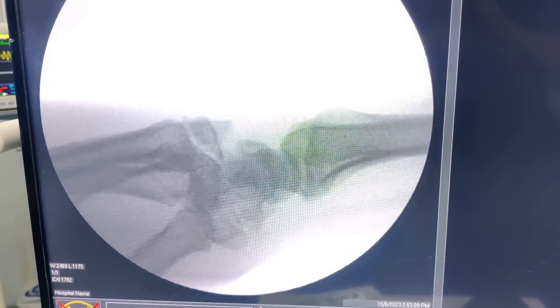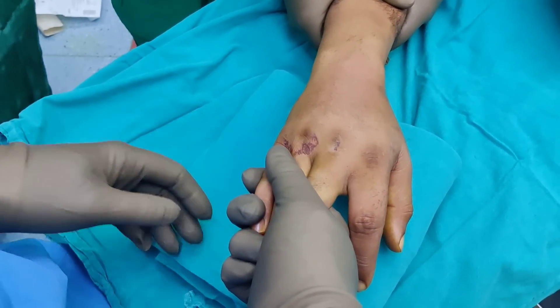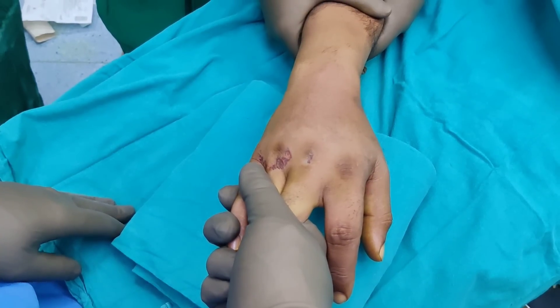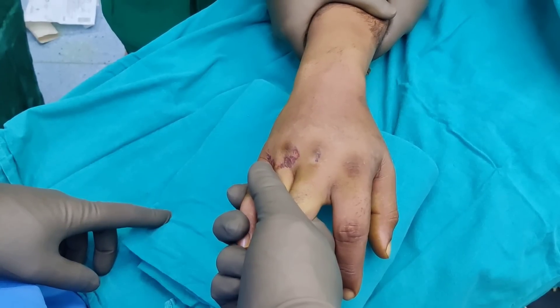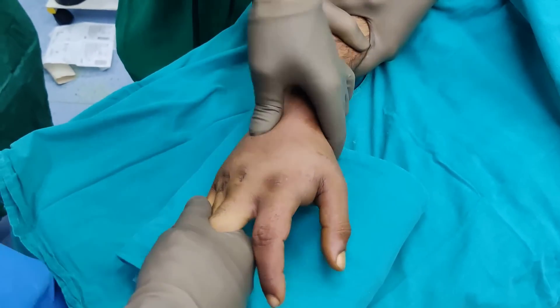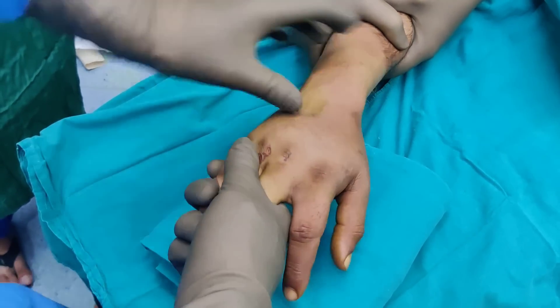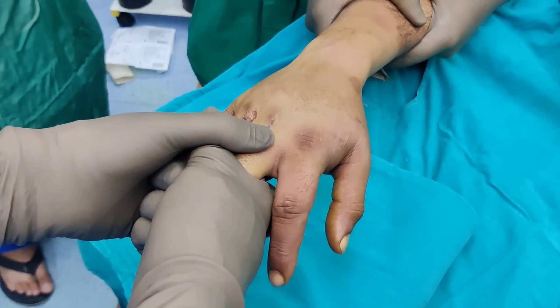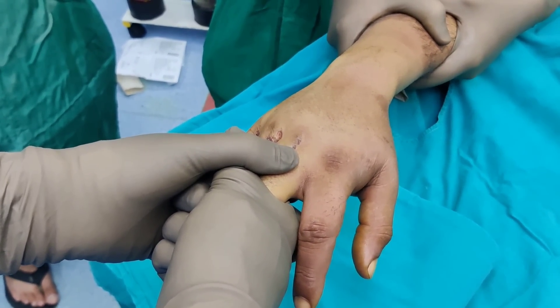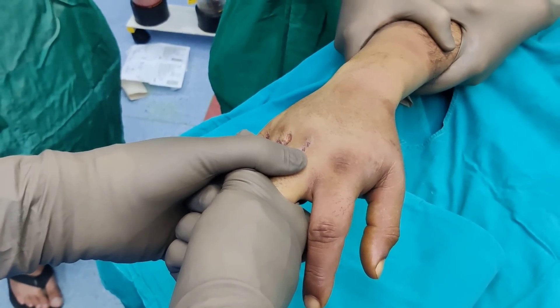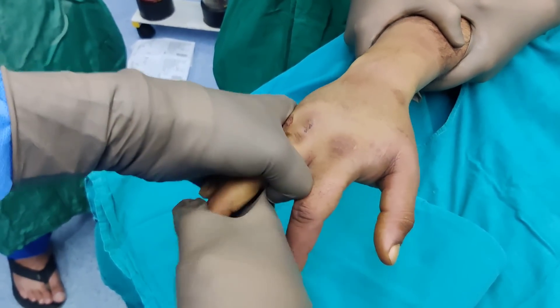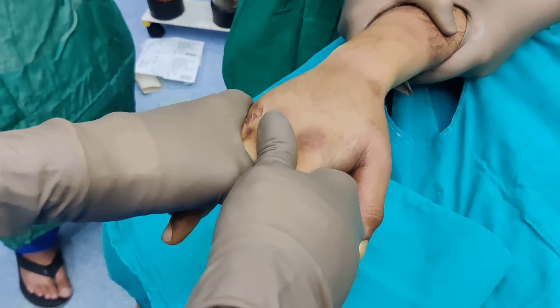A true lateral view is extremely important in these cases. Now, to do a good fixation you need to reduce the joint first, and reduction by traction is more than sufficient in most cases. My assistant Arpan is applying counter-traction while I apply traction and use my thumb to manipulate. Just apply long longitudinal traction and — as I say in most of my videos — wait around 3 to 5 minutes. This traction is usually more than enough to reduce these fractures. I will carry on for another couple of minutes and then rejoin you.